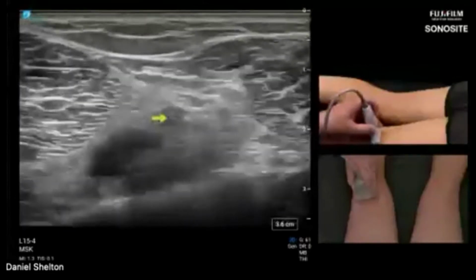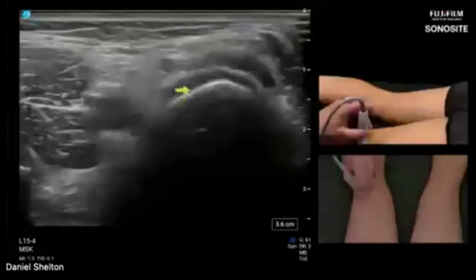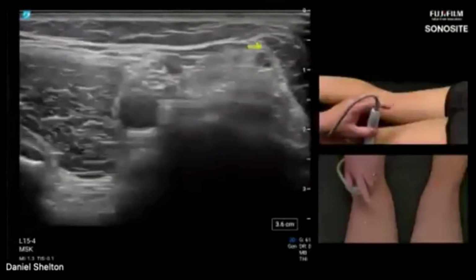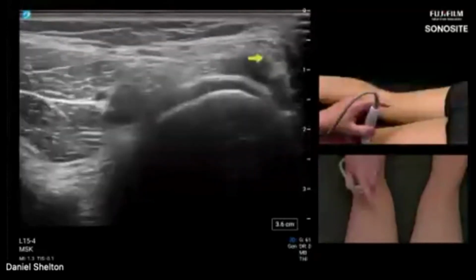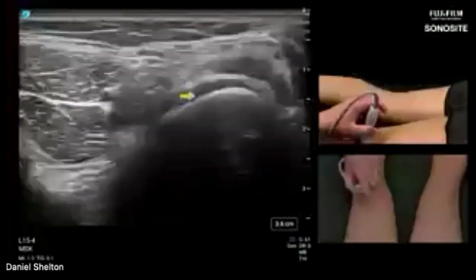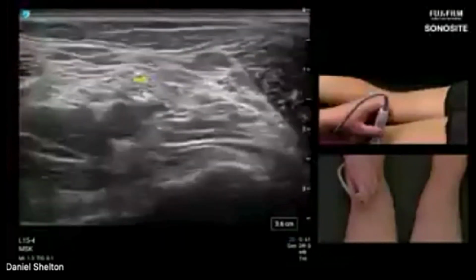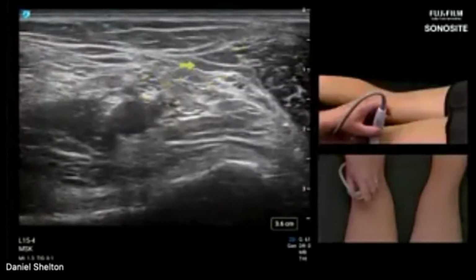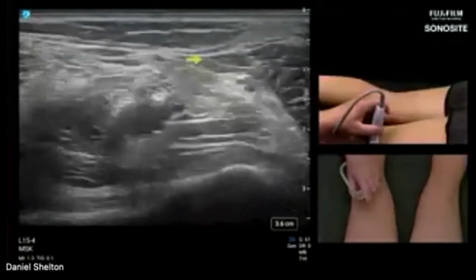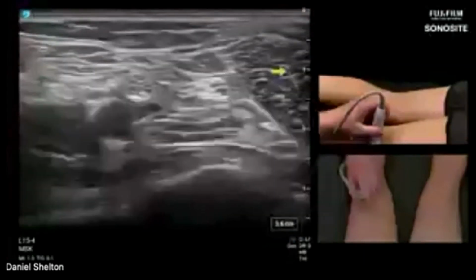Okay, so this is where we were. Here's the level of the lateral femoral condyle. I expect to see the peroneal nerve over here kicking out laterally, and I've seen it a lot, so I've already seen it here. But if you don't see it, keep following this nerve proximally from the lateral femoral condyle level. And out here in the subcutaneous fat, right here, this is all sub fat. All right, there's no muscle or anything here just yet. This is the biceps femoris muscle. This is our landmark, just like I showed you in that anatomy diagram.